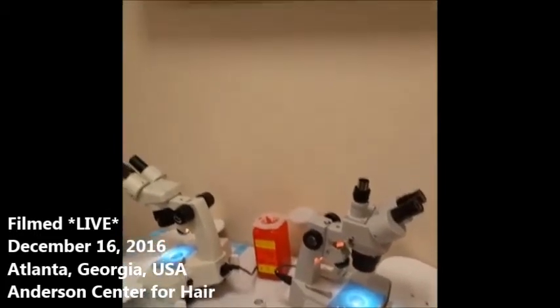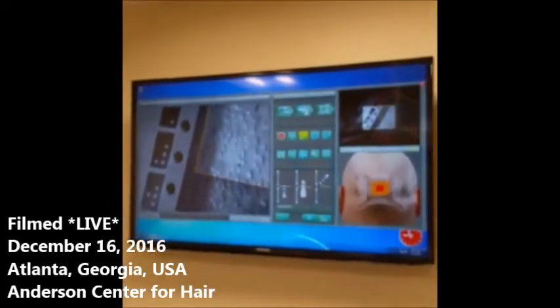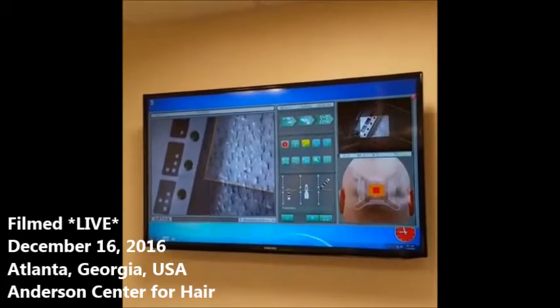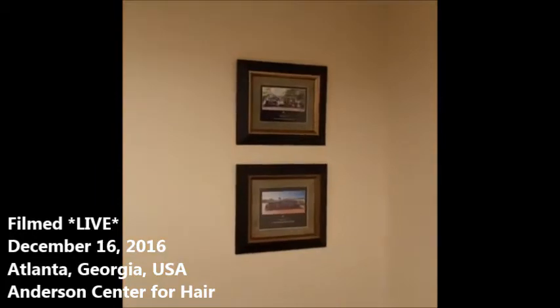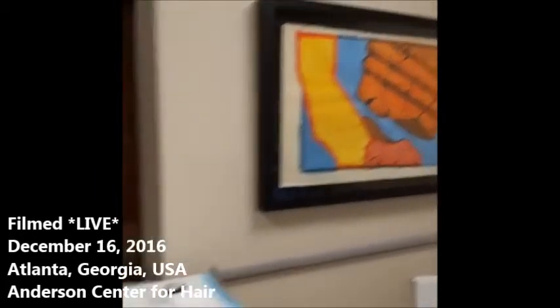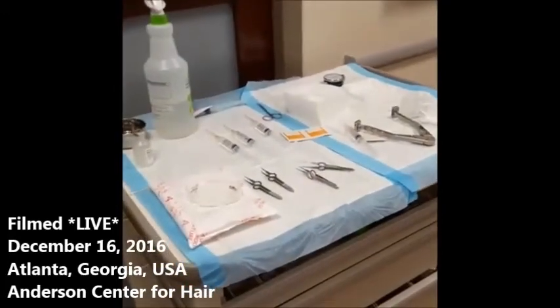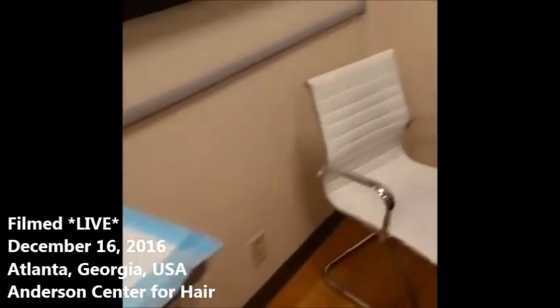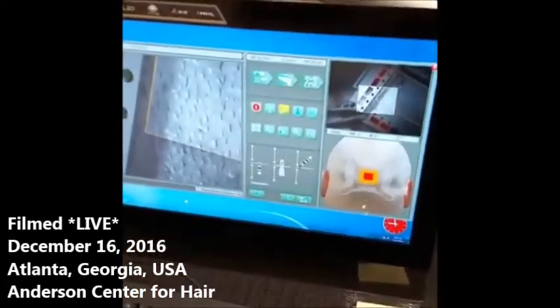Every one is accounted for — we want to be very accurate. I've got the monitor here, which is exactly the same as what I'm looking at at the surgeon's user interface. This is the surgical cart that has all the tools we're going to need for today to perform the procedure, and this is the surgeon's operating station where I sit and control the robot.